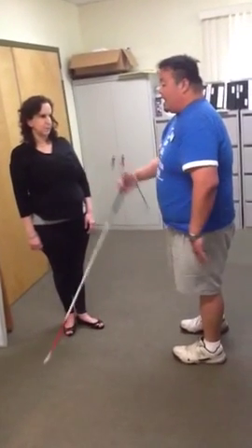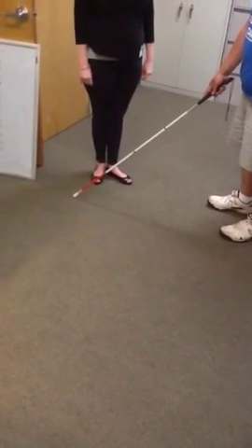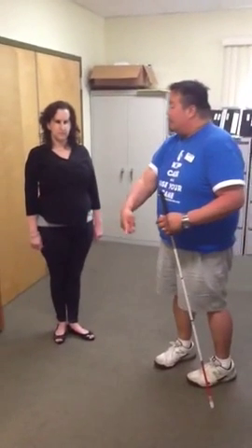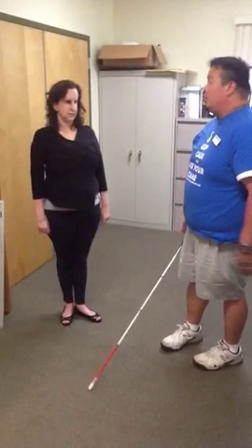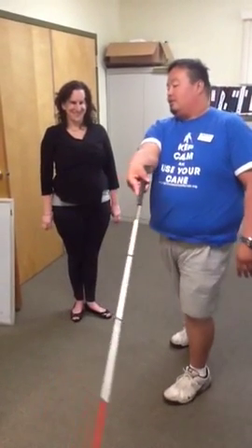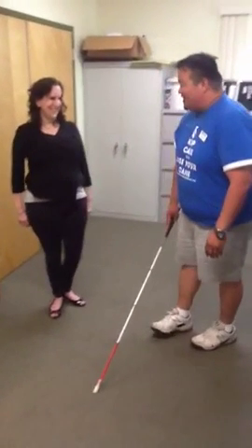Okay. And what a cane does is it provides you information with your environment. It's like taking your finger and extending it out. You're going to feel what's in front of you. A cane will not tell you where to go. It's not a magic tool. It's not like, take me to the store, and the cane just goes to the store. That's not what it's used for.